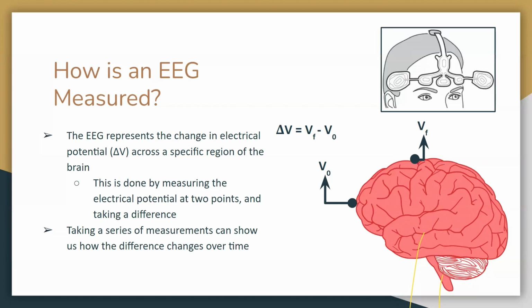Essentially dB is made-up magic units, and it depends on what your reference voltage was and the resistance of the patient's brain. So what I'm getting at is that you can anticipate higher power in younger patients and lower power in older patients, but there's no firm conversion between decibels and raw voltage. It's really something you'll have to play with for your patients.